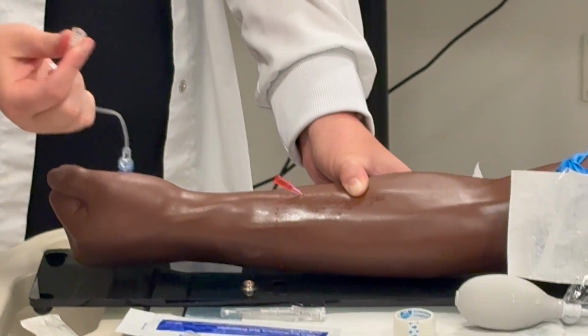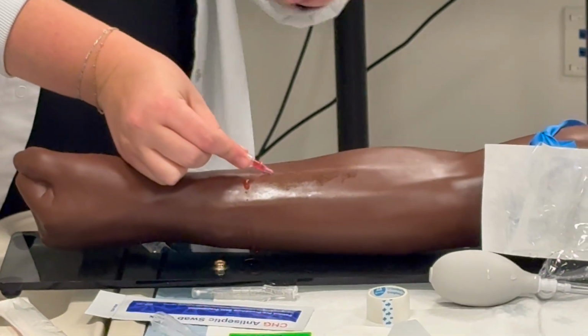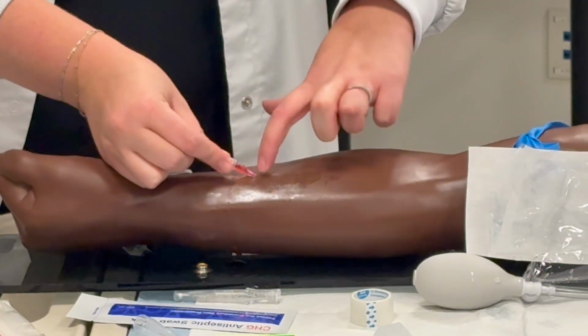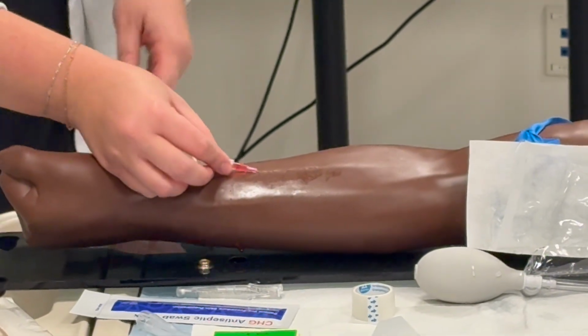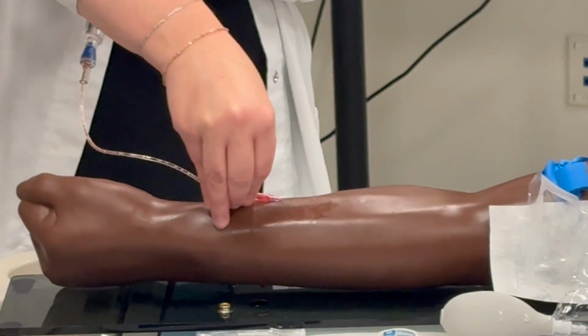So I'm gonna pull this together, push. Now I can let go because all the blood then would flow into here. I'm going to pinch right here, being very careful not to touch the opening right here and not to contaminate, okay? All right, now I'm gonna flush. So I'm gonna pull back. When I pull back, what am I looking for? Do I have it? Yes.